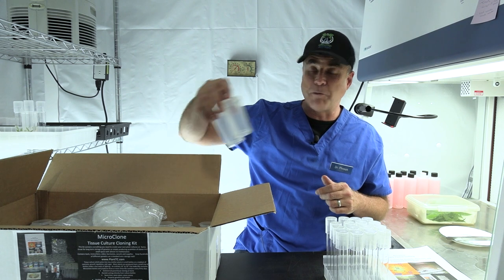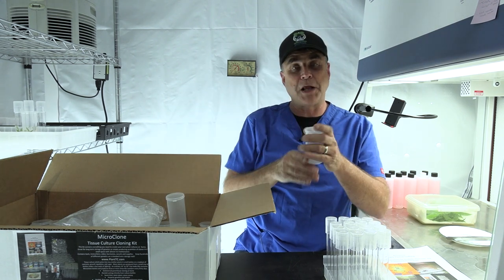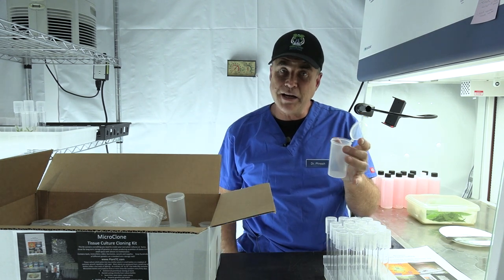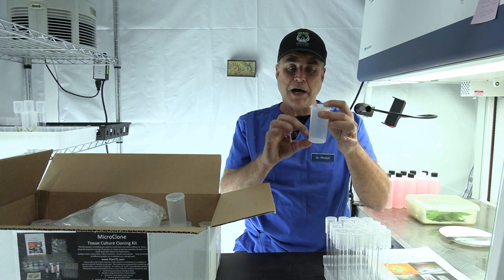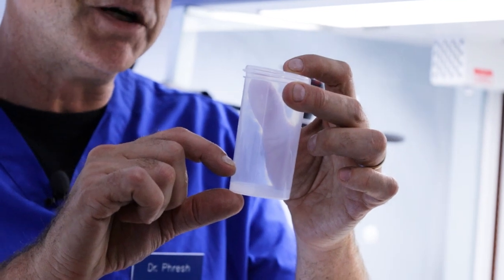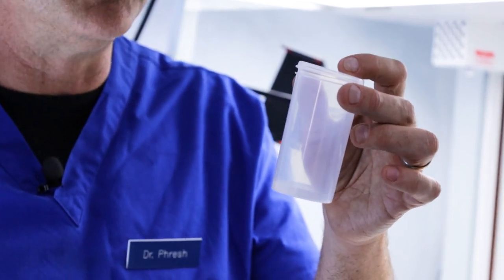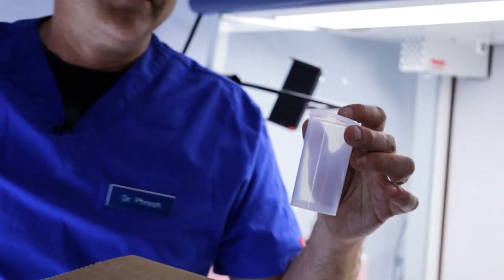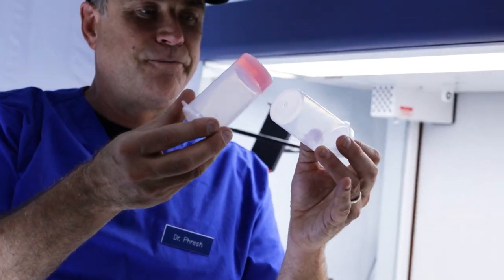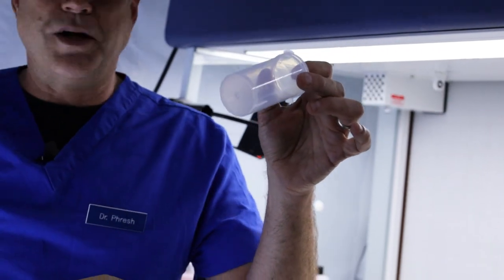We also have about 50 of these four-ounce polypropylene flip tops — everything here can be pressure sterilized. These are wonderful because we'll put about 25 or 30 mils of media in here. They'll be hardened with agar, and it'll look just like that. So this is what you're making, this is what you're starting with.